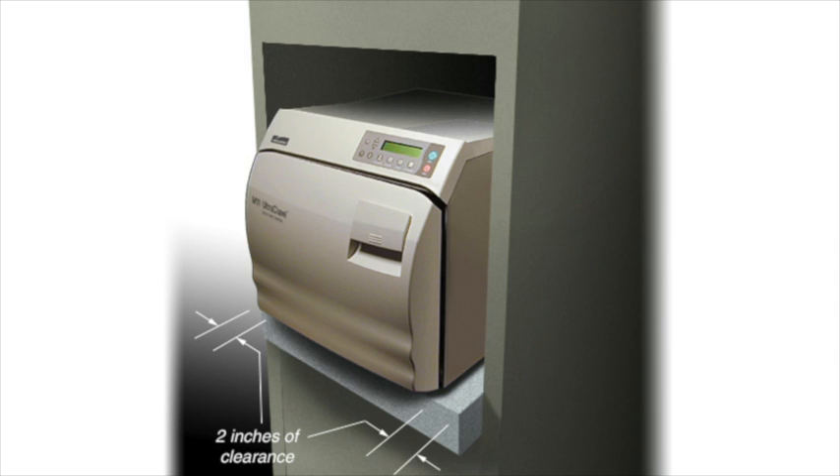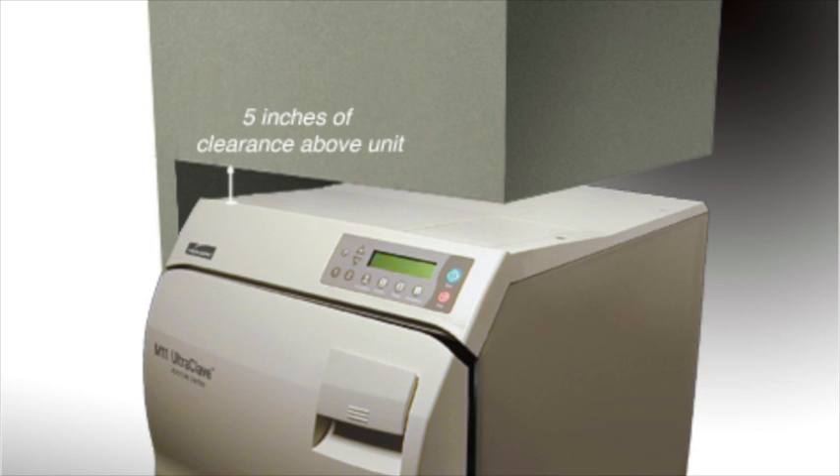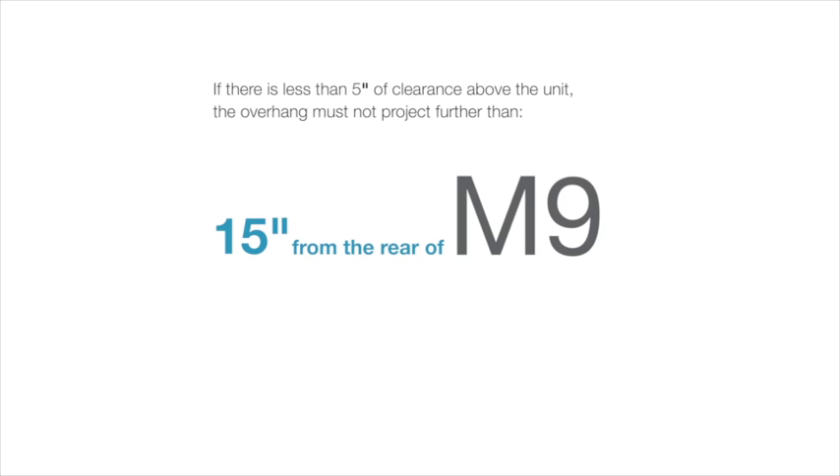If installing the unit beneath a cabinet, shelf, or overhang, a minimum clearance of 5 inches must be maintained above the unit to allow the operator to change the paper roll if the optional printer is installed. If there is less than 5 inches of clearance above the unit, the overhang must not project further than 15 inches from the rear of the M9.